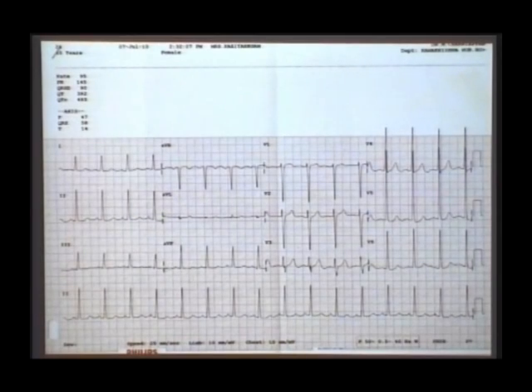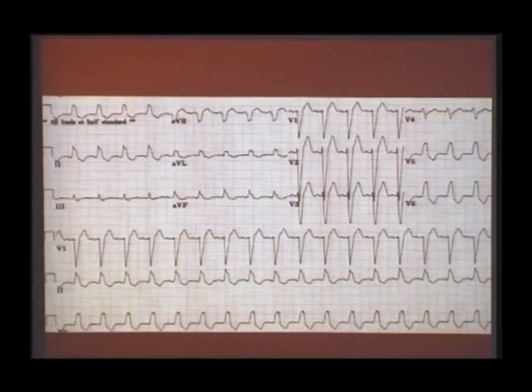Right. Now you can look at the ECG here. See the QRS amplitude here: 1, 2, 3, 4, 5, 6, 7 or 8, 40 millimeters. What does it mean? Exceeding 26 millimeters is abnormal. So this ECG tells you ventricular enlargement is there. Whereas see the QRS duration here. What is the duration of QRS here? 1 big square. 1 big square means 0.2 seconds. The normal duration is 0.08. Here the QRS is wide. What diagnosis is this? Bundle branch block.